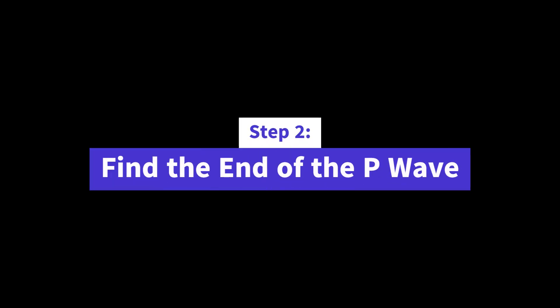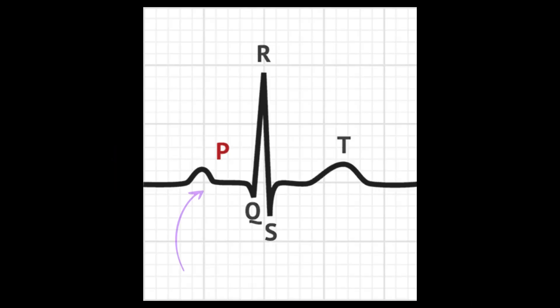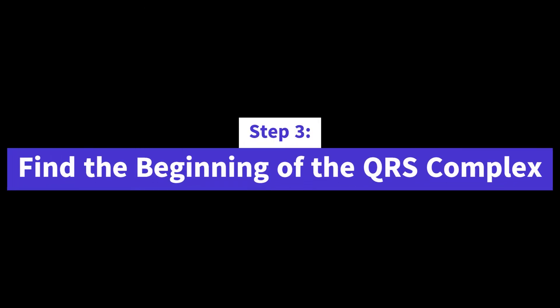Step 2: Find the end of the P wave. The end of the P wave is the point where the wave returns to the baseline. Step 3: Find the beginning of the QRS complex.